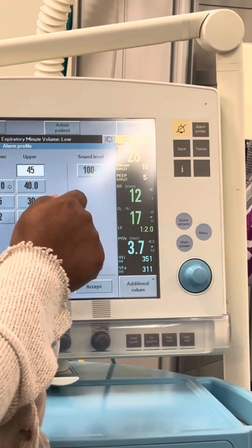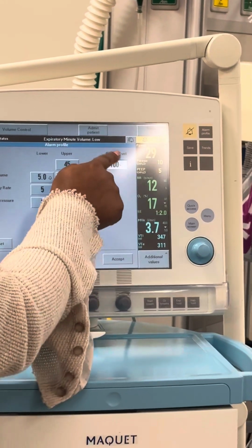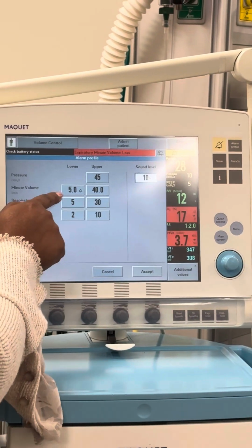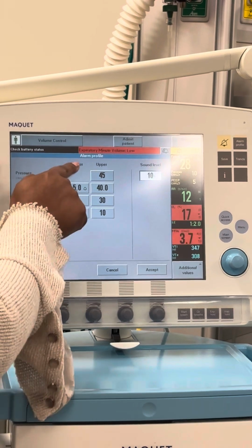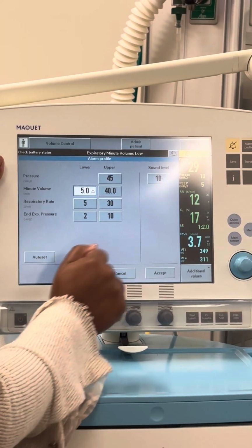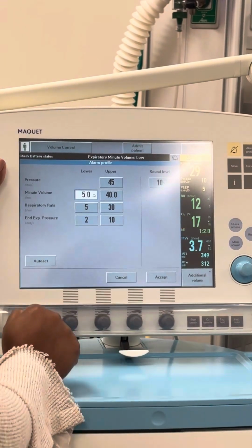I'm going crazy today. So I'm going to turn my sound level down, because it's just really loud. All right. So now these actually have lows and highs. So this one's minute ventilation. My minute ventilation, you can read right here, is at 3.7.